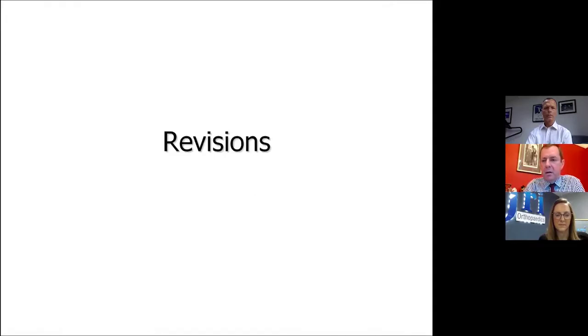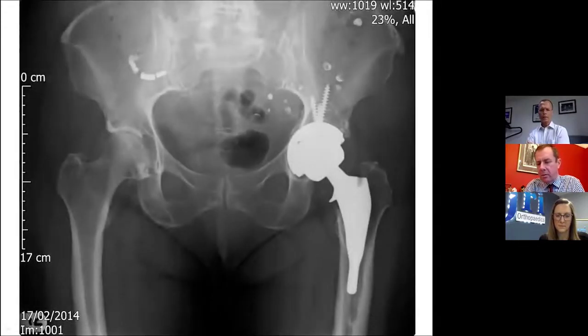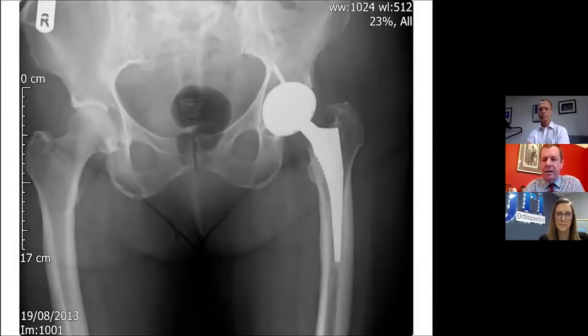My cases are actually revisions using the Evolution. So I've shown my revisions of Evolutions. These are a few examples. This is a small Corail, which I've been watching for several years. There was proximal lucency, which gradually spread down around the stem. It was pain-free until the end, when it finally broke loose from this distal bit of fixation. And I ignored the conventional wisdom that you have to go longer than the defect. There's no real bone defect below this, so I was able to revise that quite satisfactorily with an Evolution. I also revised the cup because the cup was quite malpositioned. It was a little over-antiverted, let's say. That is extreme antiversion.